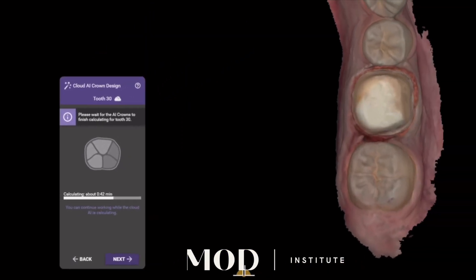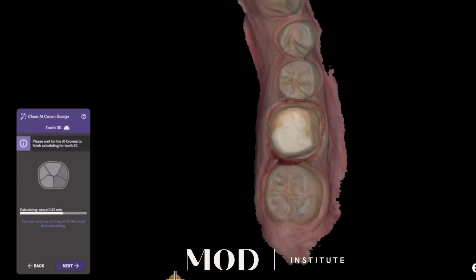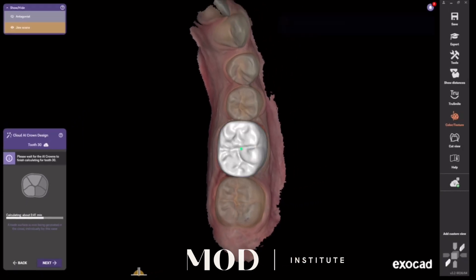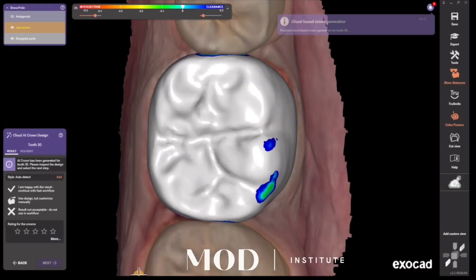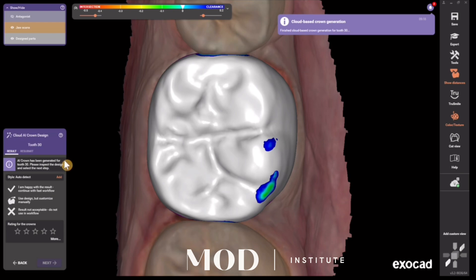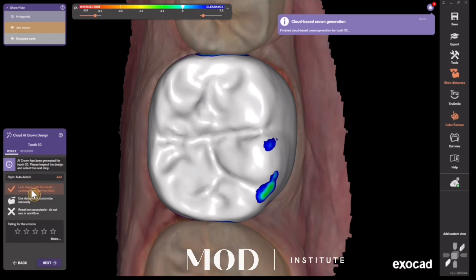You'll see the tooth just fly in, and then you can either reject it and get a new AI proposal, go ahead and edit it, or click that you're happy with it and hit Next.